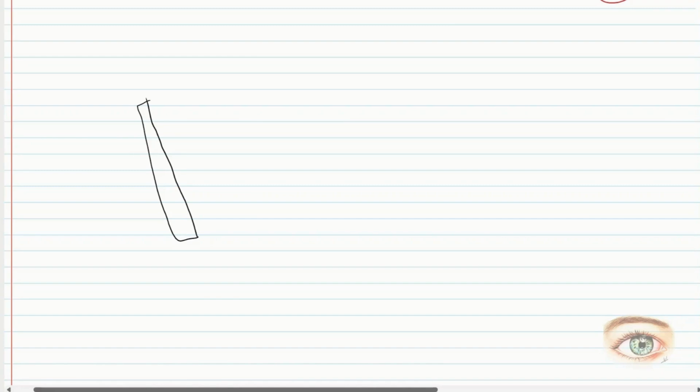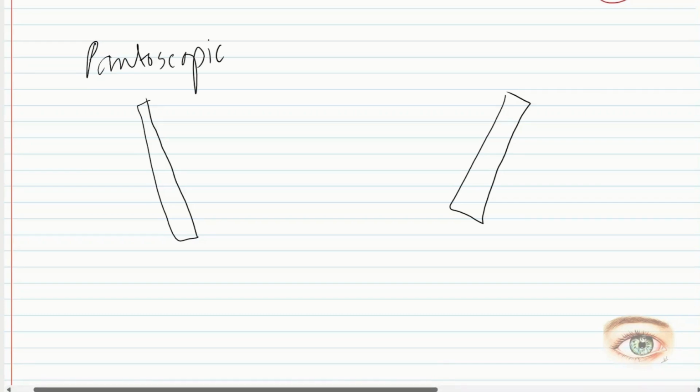We do a pantoscopic tilt and we do a retroscopic tilt.